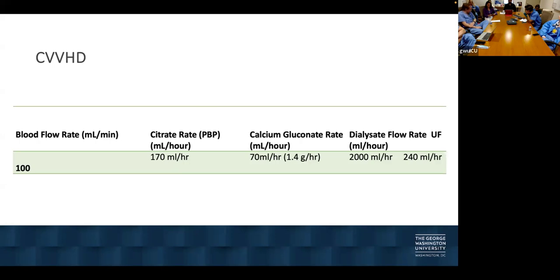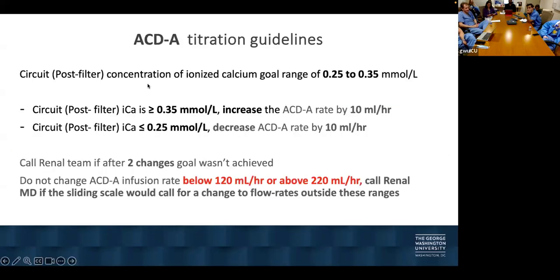I feel like the sick people are the people that clot most often. Yeah. Well, in the first 12 hours, you know how things are, you don't want to add more risk. Yeah. We'll just blame it on the catheter. That's what we do.